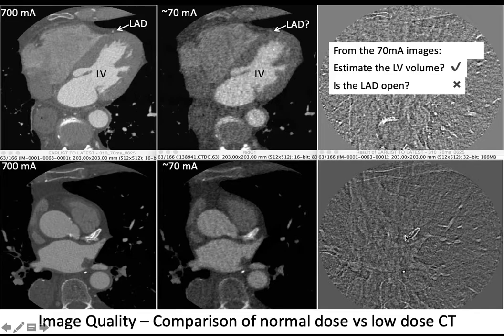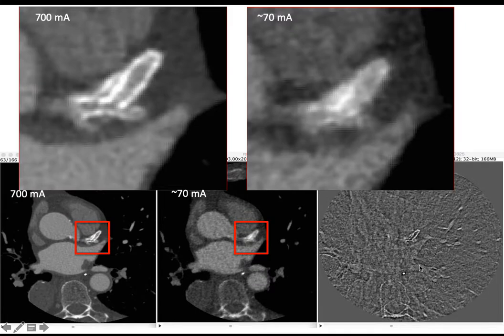It's shown here on the difference image. Maybe that's easier. So is this vessel open? At least the calcium seems like it's stuck on the outside walls, but the impression you get here is that this thing might actually be blocking the whole vessel.